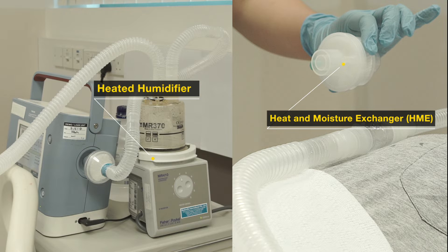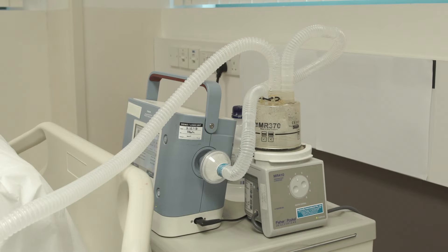When using the ventilator, there are two ways to warm and humidify the air delivered. A heated humidifier is a device that makes the inhaled air warm and moist by actively heating the air, and it prevents secretions from thickening.